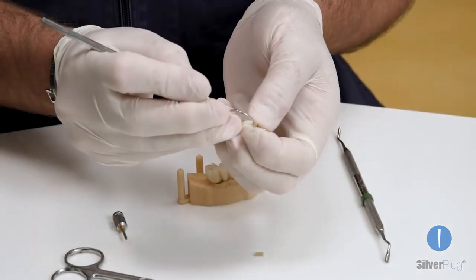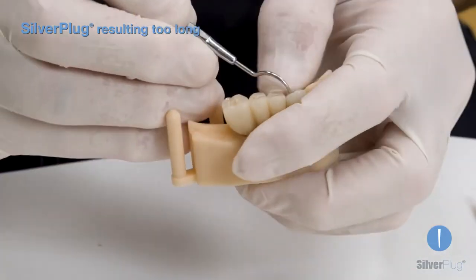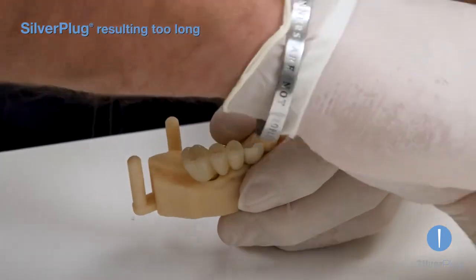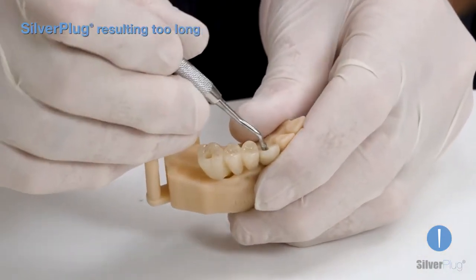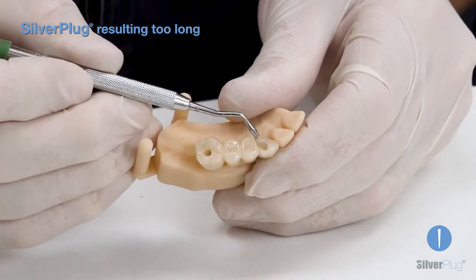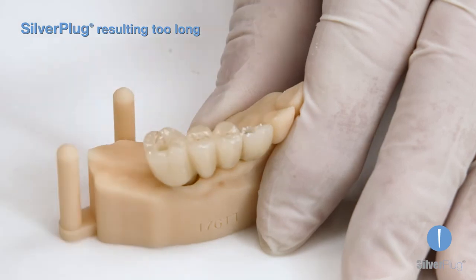After cutting a section of SilverPlug and inserting it into the implant tunnel, it might happen to be slightly too long, not leaving enough space for the composite or cement layer. In this case, it is possible to trim part of the SilverPlug off with a polishing burr until the desired space is obtained.